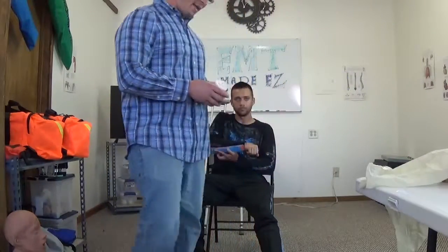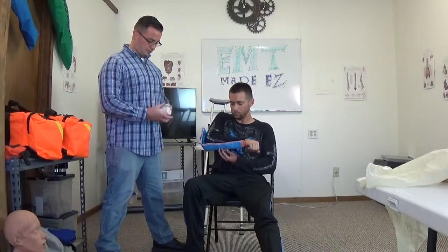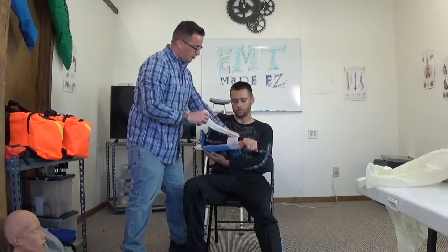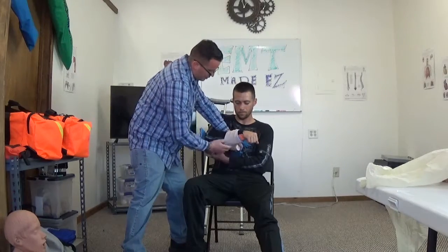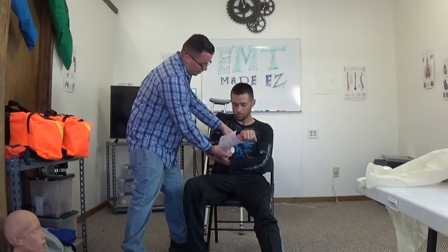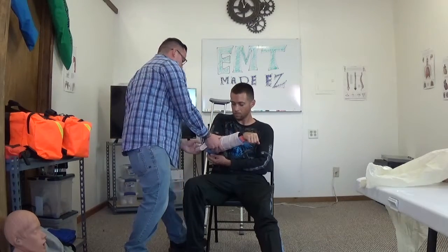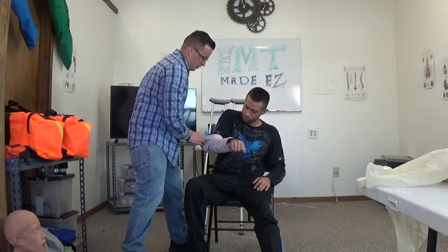Now we're going to get a bandage to wrap around the Sam splint and the arm so it doesn't go anywhere. There is no right way of starting it — you can start from anywhere you want. Make sure it's nice and tight on the patient, but not so tight that you're constricting blood flow — just enough to maintain the Sam splint on the patient's arm.